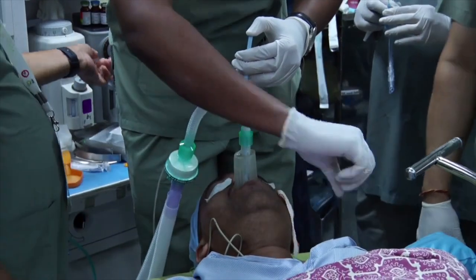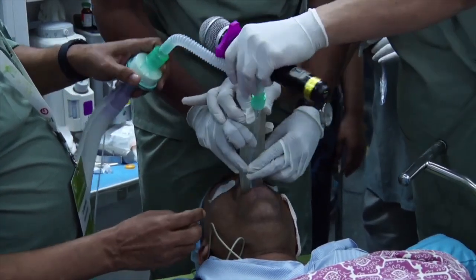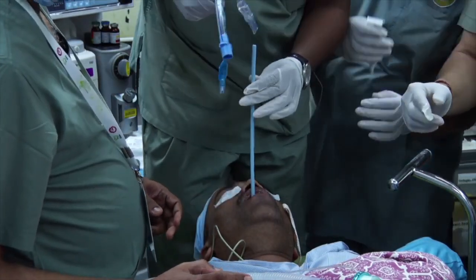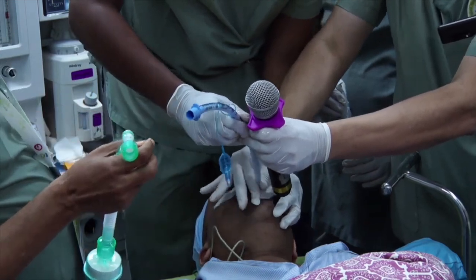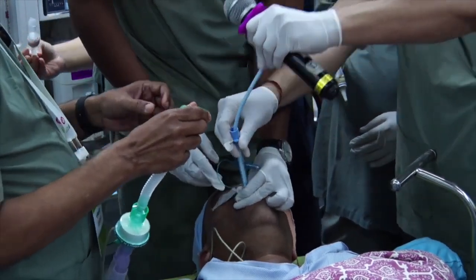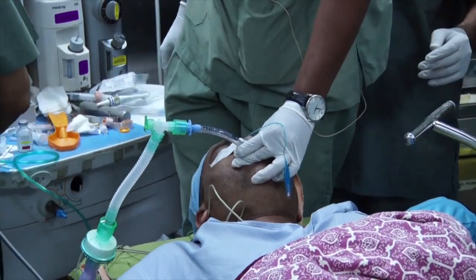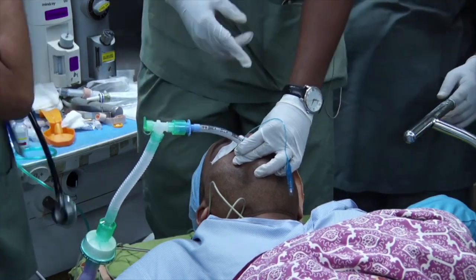We'll disconnect so you have some more space. You can practice this technique tomorrow. Don't worry about the size, it'll be fine. Somebody holds it — inflate the cuff. We can start ventilating the patient. We need to confirm the position — we can see misting of the tube, you're getting CO2, and you can confirm the position with the bronchoscope.